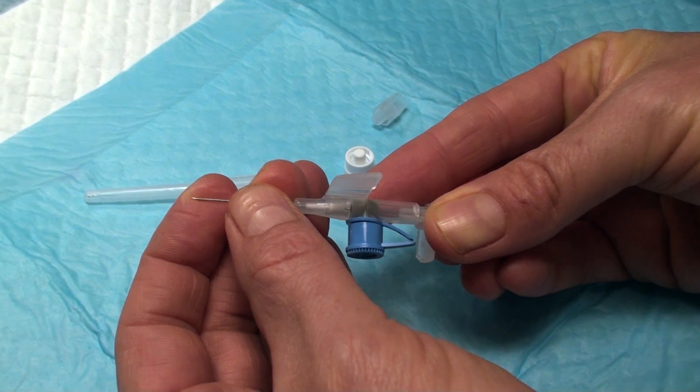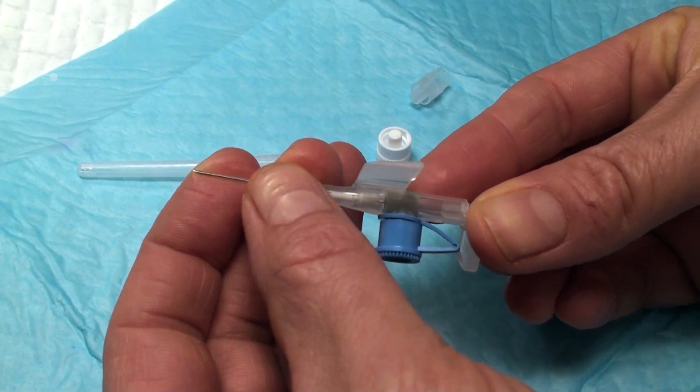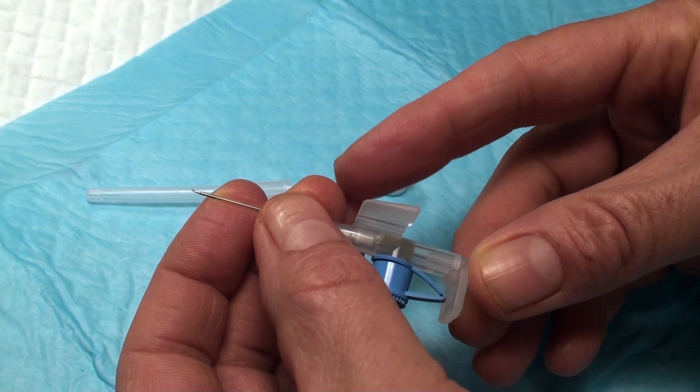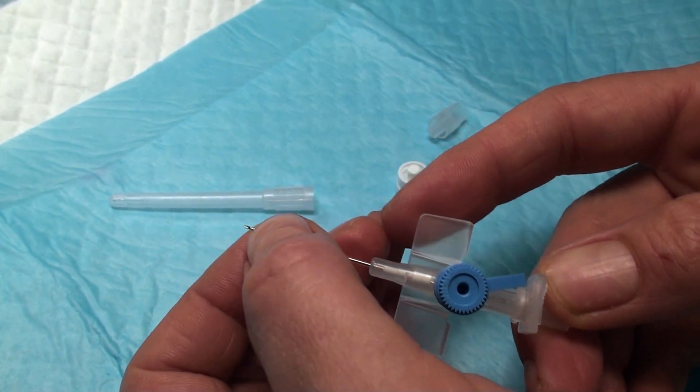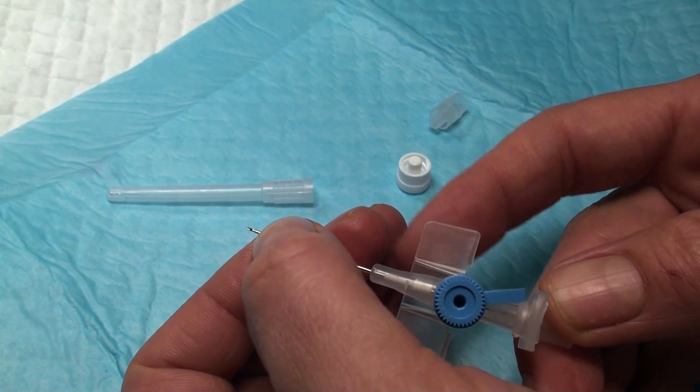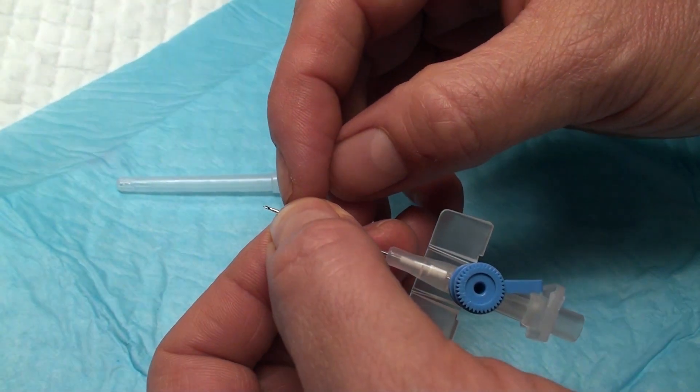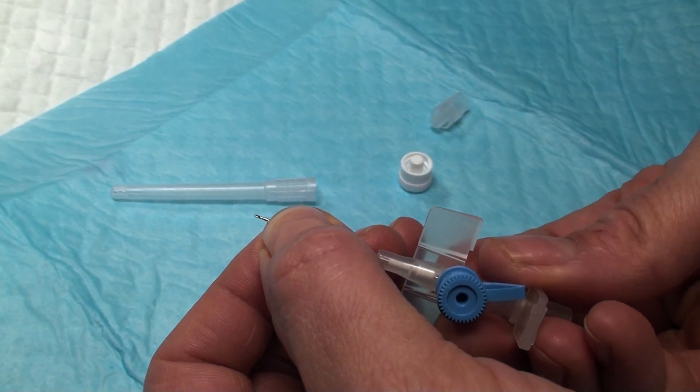This means that when you introduce the catheter into the vein, you will puncture the vein with the needle. You will have to be sure that you puncture the skin and the vein for a couple of millimeters before you take the needle back.